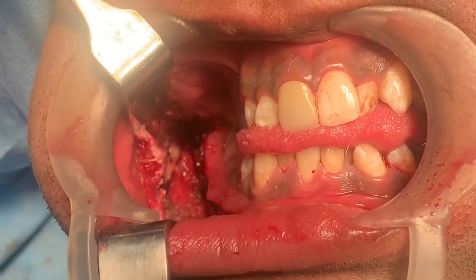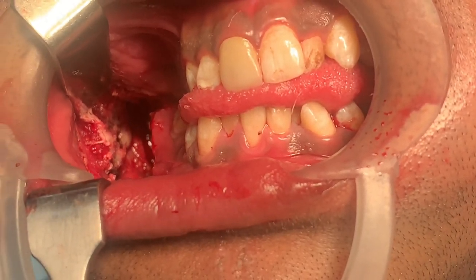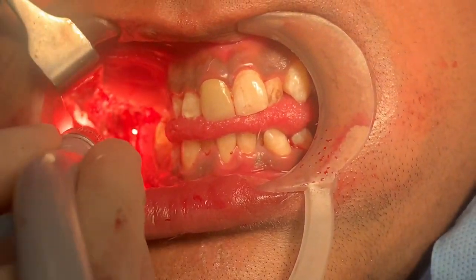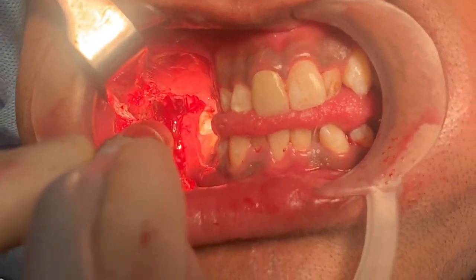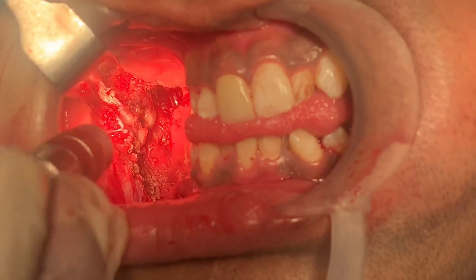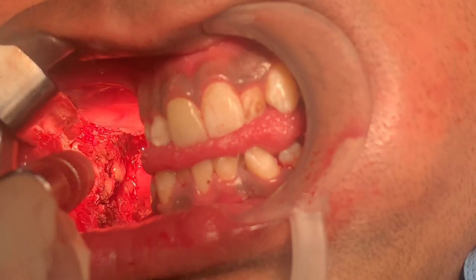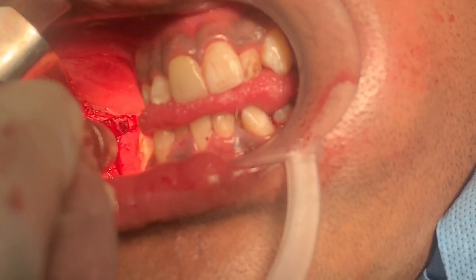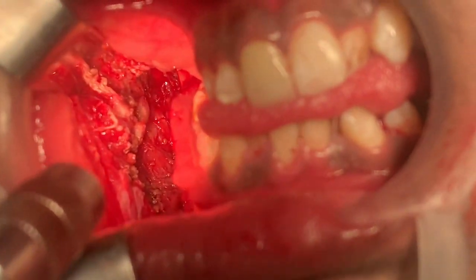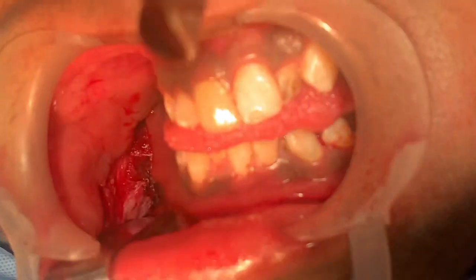One of the things that's really hard to do is to make sure you have very good hemostasis at the very end of these kinds of procedures, because we're dealing with the masseter muscle and its attachment and it's very, very vascular. This is after the osteoplasty — first osteotomy, osteoplasty, some muscle work — and now we've achieved hemostasis. Even after that there's a small welling up of blood. There's also a nerve just ahead, and we've done similar work on the other side.